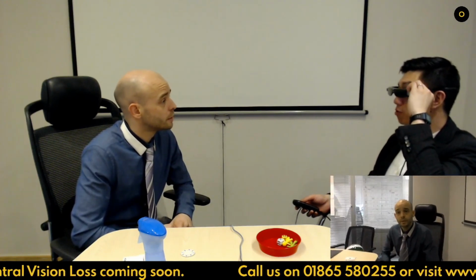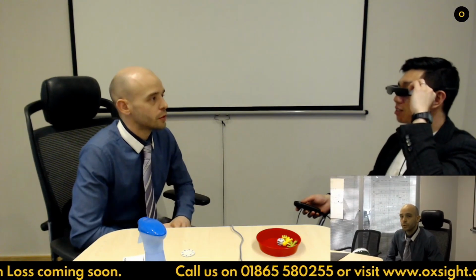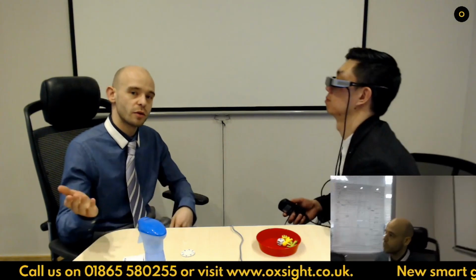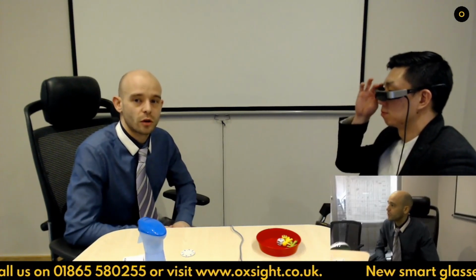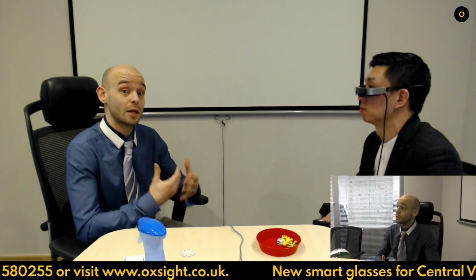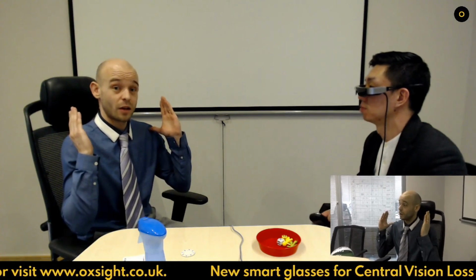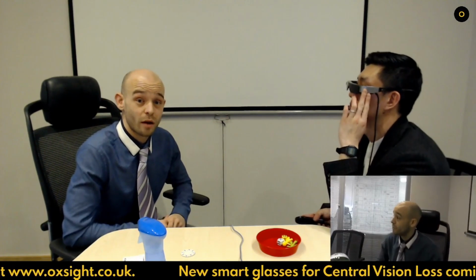And so do you find that most people use the normal mode the most? Normal mode is generally what people use the most, because you can pretty much use it in most environments. One thing it's really good for is scenery. If you're going on holiday, for example, and you want to absorb the architecture or the scenery or the beach that you're on, you can put these on and take in that 68-degree field of view. Generally speaking, our patients will go from seeing maybe out to shoulders, so about this distance away, and then they go to seeing what you're seeing now. It's quite a vast improvement.